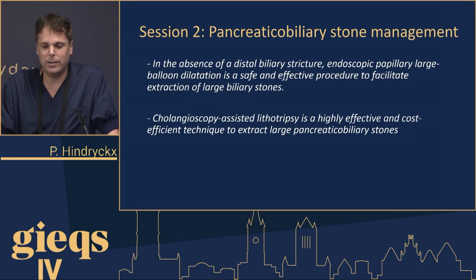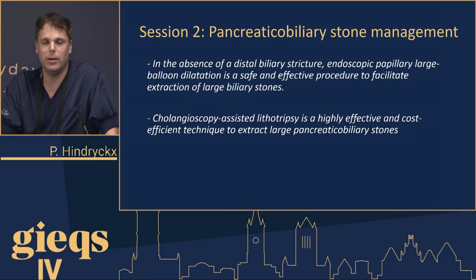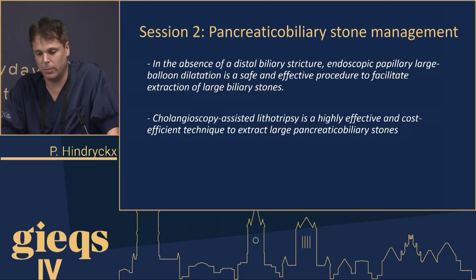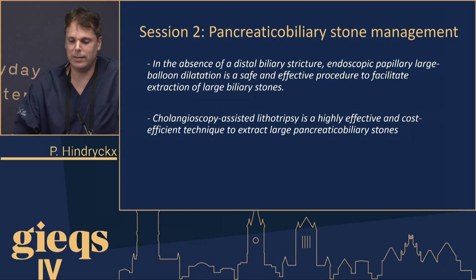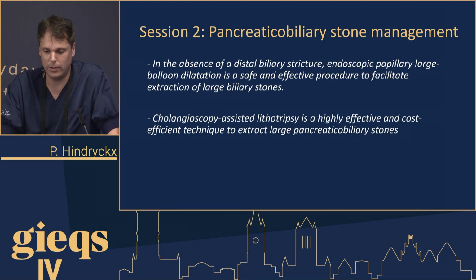After that session, we had a session on pancreaticobiliary stone management. I would say that the key messages here were that in the absence of a distal biliary stricture, endoscopic papillary large balloon dilatation is a safe and effective procedure to facilitate extraction of large biliary stones. We had a nice case of a large biliary stone trapped in the common bile duct, for which cholangioscopy-assisted lithotripsy was performed. And this cholangioscopy-assisted lithotripsy is a highly effective and cost-efficient technique to extract such large pancreaticobiliary stones.